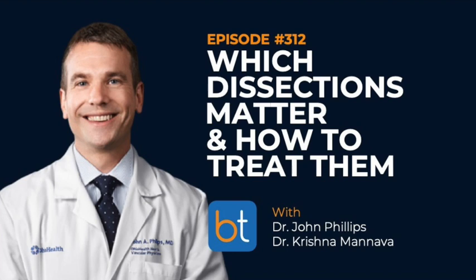Because you can get into trouble with them. After you deploy them, you have to post-dilate them with a fresh balloon. You don't want anything winged because they can catch and tumble on you. The ones in the tibials, the smaller ones, the 1.5 to 4.5s, work well also. But again, there's a fair amount of calcification in the tibials, whether we see it or not, and that medial calcification is always a problem. So you have to be careful when you use them down there.